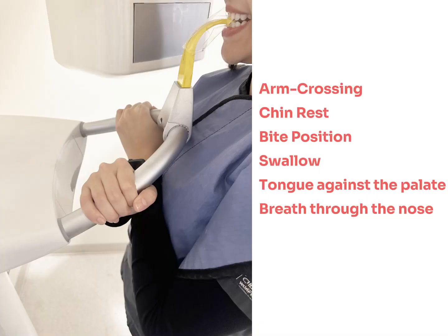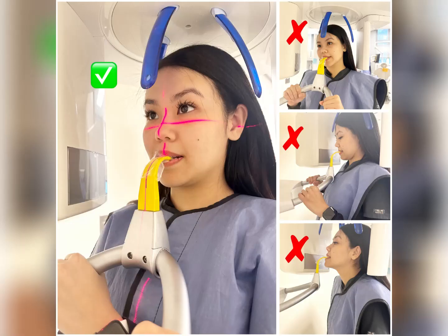Following this, they should swallow, place the tongue against the palate, remain still, and we should remind the patient to breathe through their nose. Sometimes patients will turn their heads around during the exposure to watch the machine move.